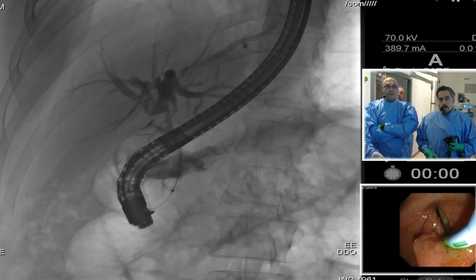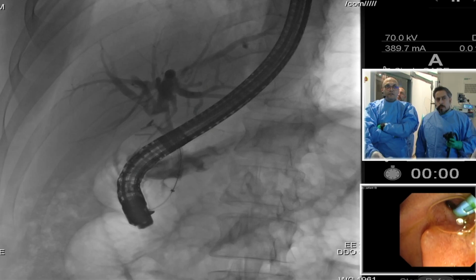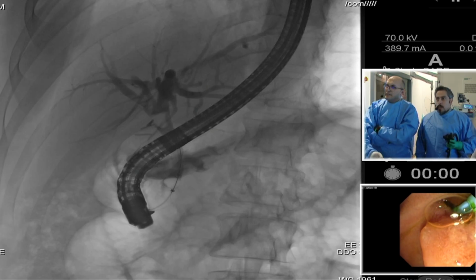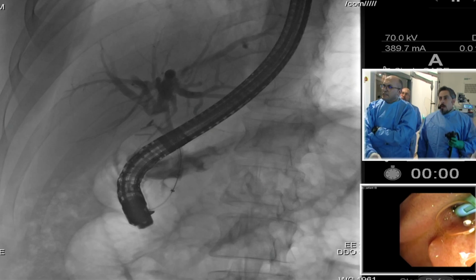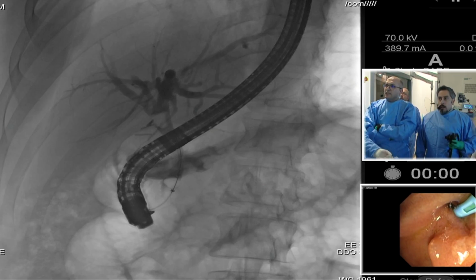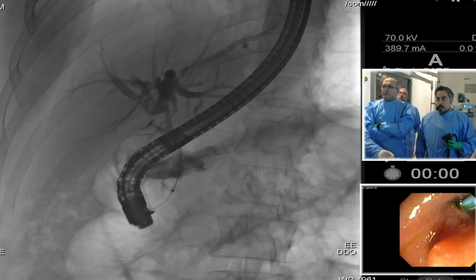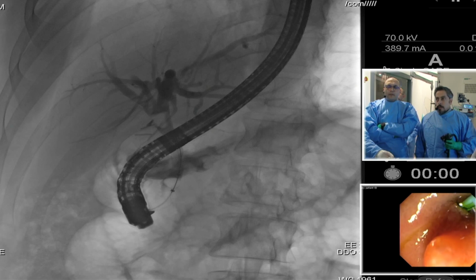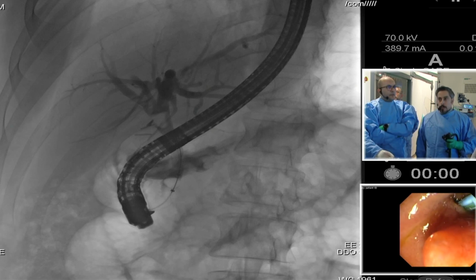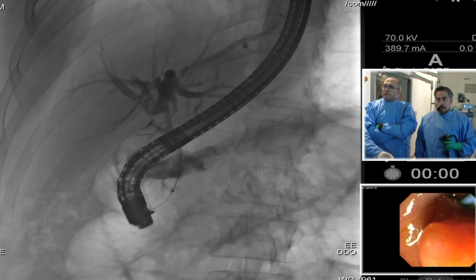The question is still, I have multiple right hepatic duct stones above that stone, and I have a left hepatic duct stone also, and the intrahepatic ducts are dilated, and I can see many surgical clips. So it was not an easy cholecystectomy, it looks like. So if the balloon is there and it is inflated almost 10 millimeter, can I go and hold the stone with the basket and then crush it?